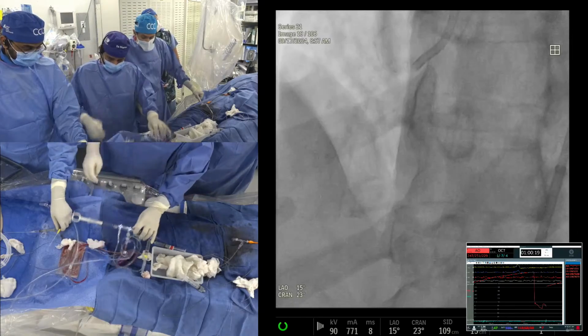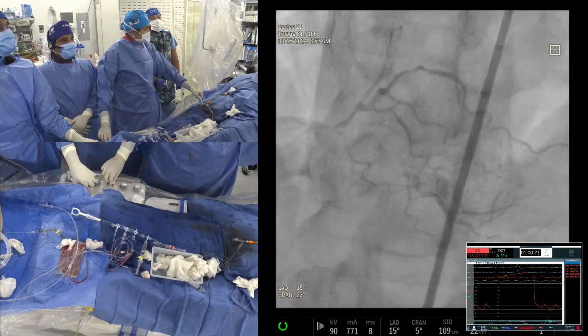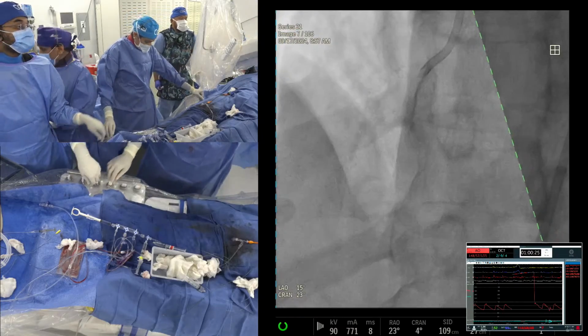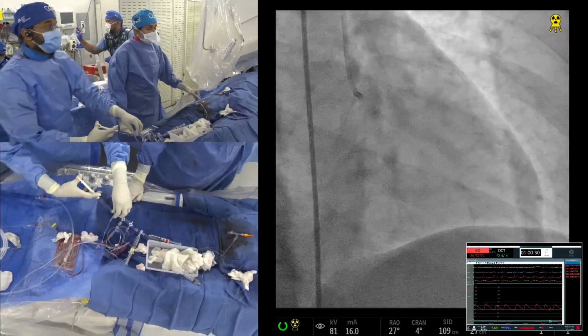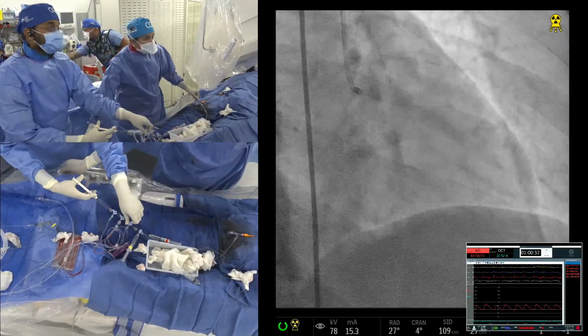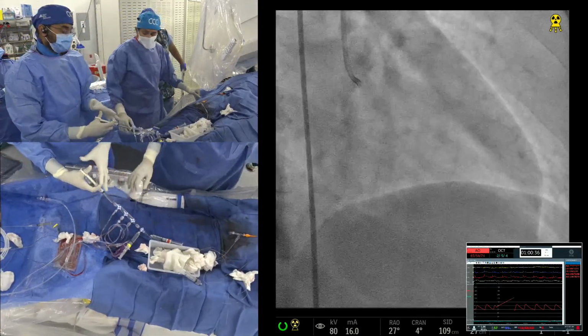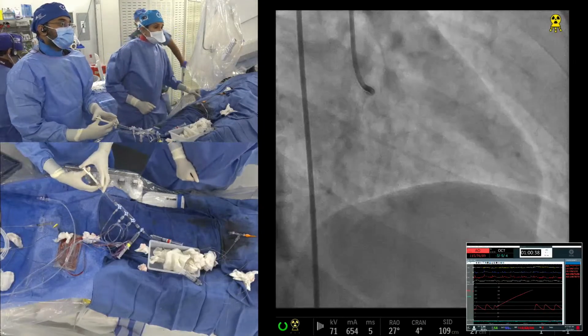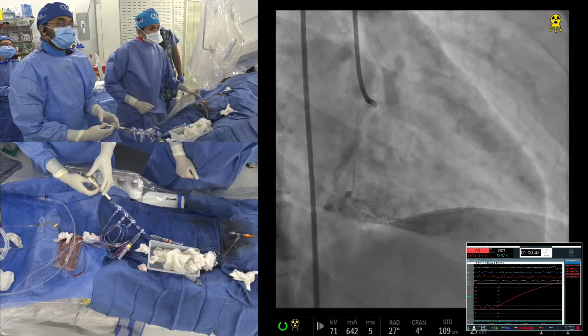Excellent. Yeah, completely done there. So the result is moderate, but I would not discard the possibility that we may have to treat it distally. In about 2 months, we'll do a stress nuclear test, and based on the inferior and lateral ischemia, we bring the patient back for part 2, part 3 actually, in this case.